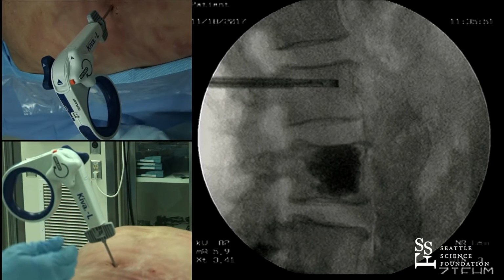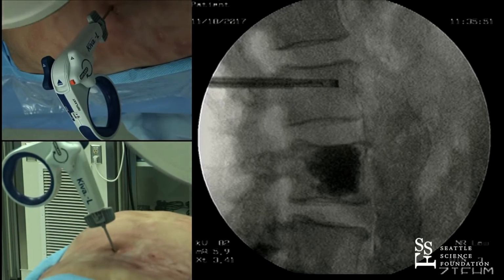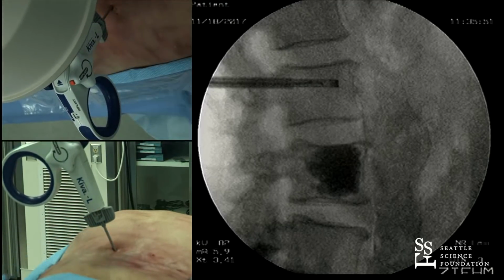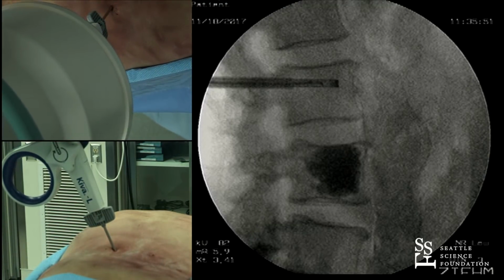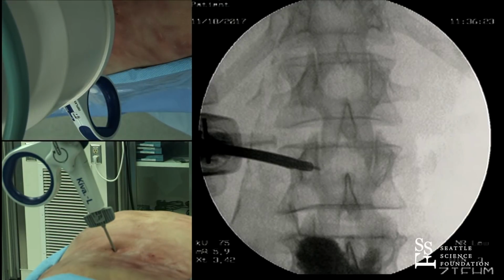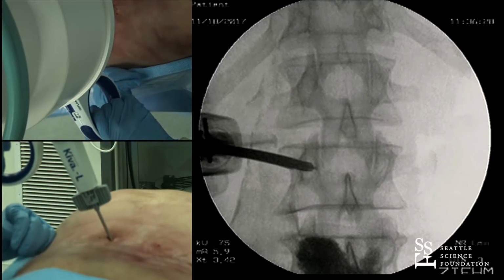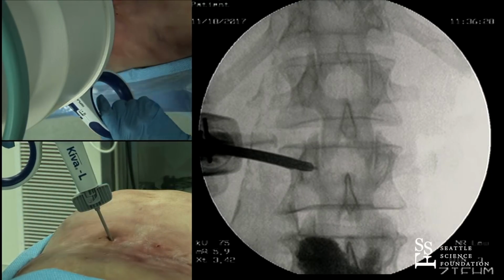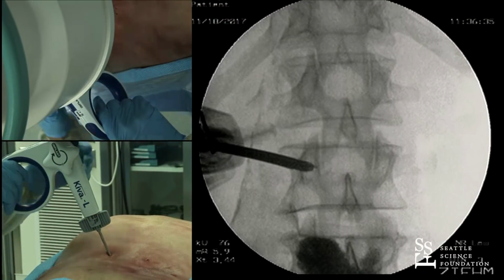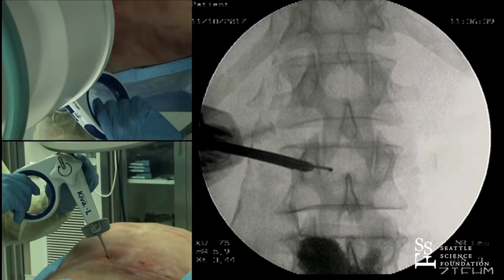And the nitinol coil is deployed first, followed by the implant. One of these things sticks up a little bit, but we can tell from the trajectory it goes toward the center of the vertebral body. So I'll start the deployment on the AP view. And it has a certain amount of declination built in. This implant is in the inner part of the vertebral body. So let's see how we do here with the deployment.